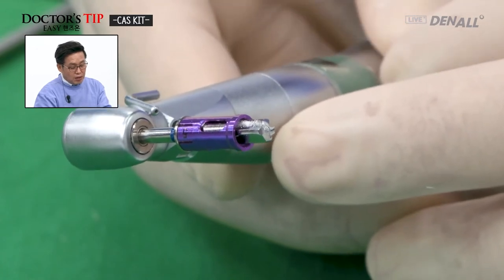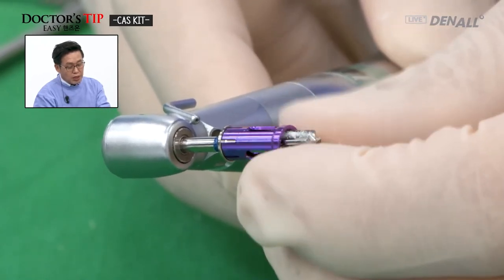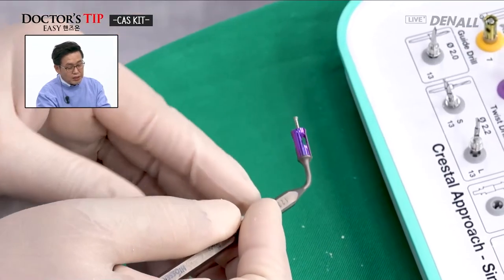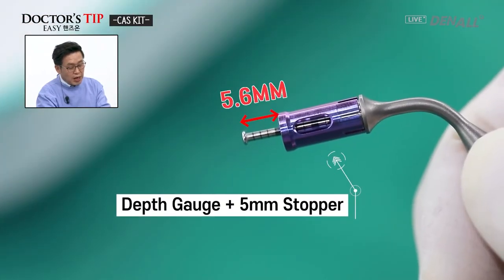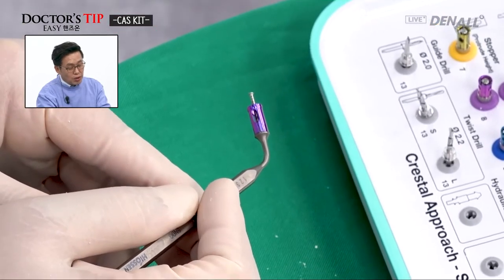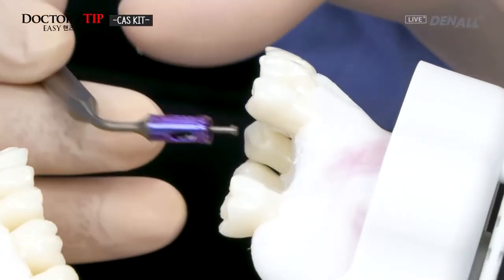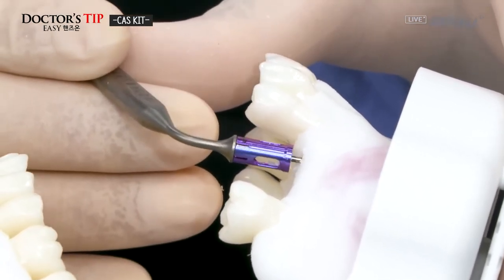So whether the sinus floor has been penetrated or not will be checked. The depth gauge will be connected with the same stopper, the 5 millimeter stopper. The drill is 5 millimeters, but the depth gauge is a little bit longer, 5.6 millimeters, and this will go into the drill hole to check whether the sinus floor is penetrated or not. As you can see, it is not penetrated yet.